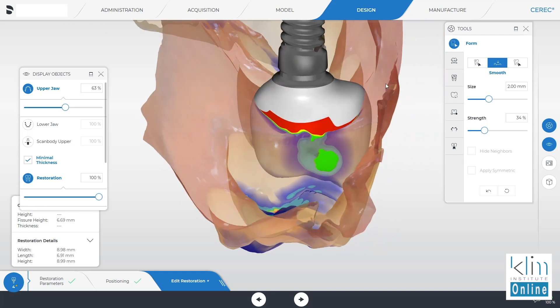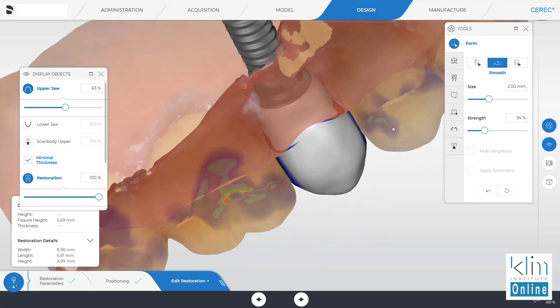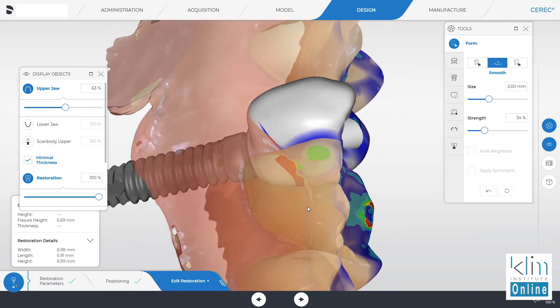I have found this to be so consistent. When we screw these down, we're going to get some blanching, so I'm going to anesthetize the patient and screw it down. I like to preserve that connective tissue. I'm usually not removing it now like I used to with electrosurgery or a laser just to clear out some of that connective tissue. As long as I don't get excessive blanching more than 10 minutes, we're going to be just fine. I've been doing it this way for years and I've never had what I call a necrosis pathological situation.